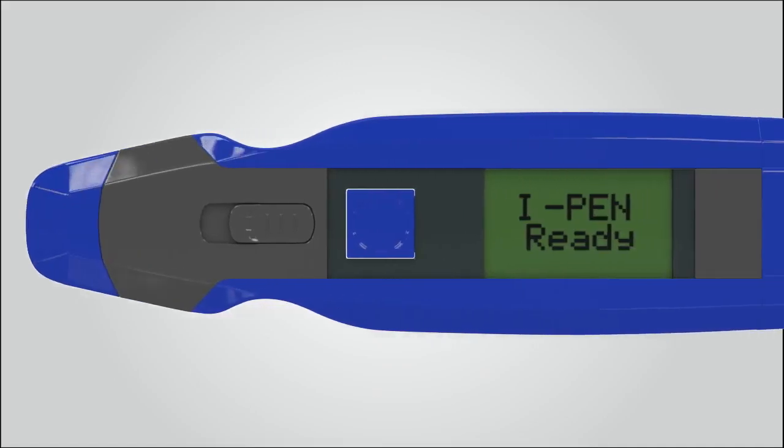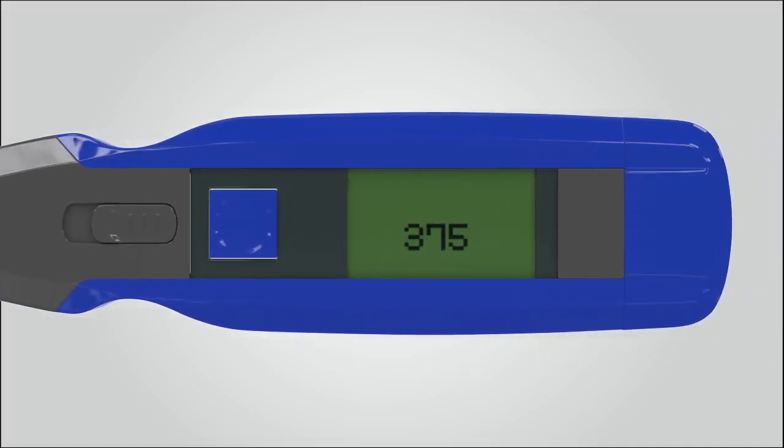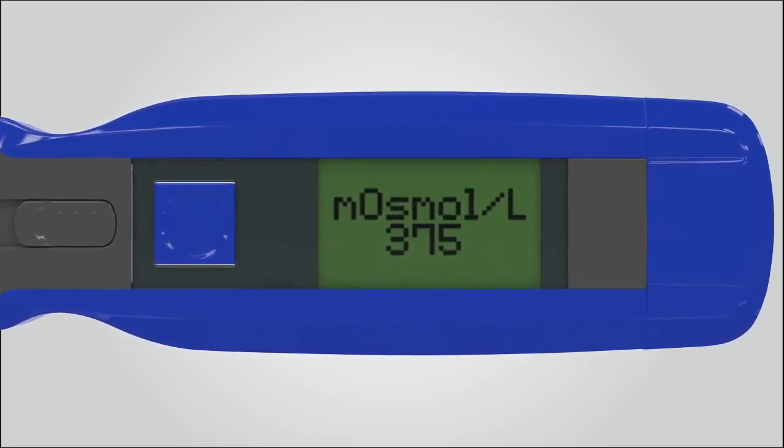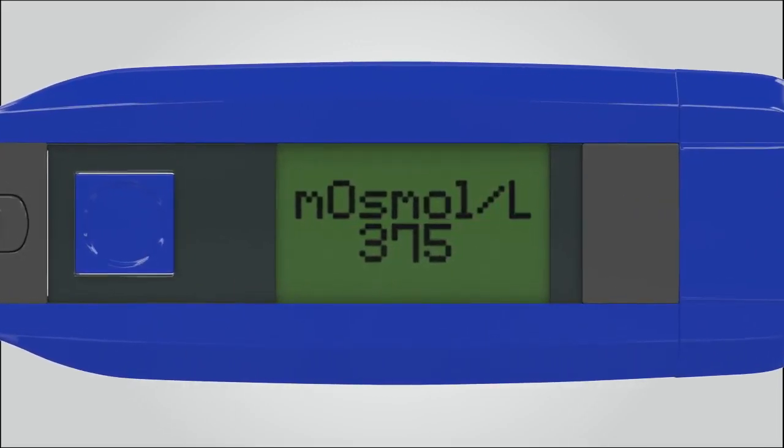The readings typically range from 275 to 375 milliosmoles per liter. These readings help eye care professionals diagnose and target treatment for ocular surface disorders that affect tear electrolyte concentrations.